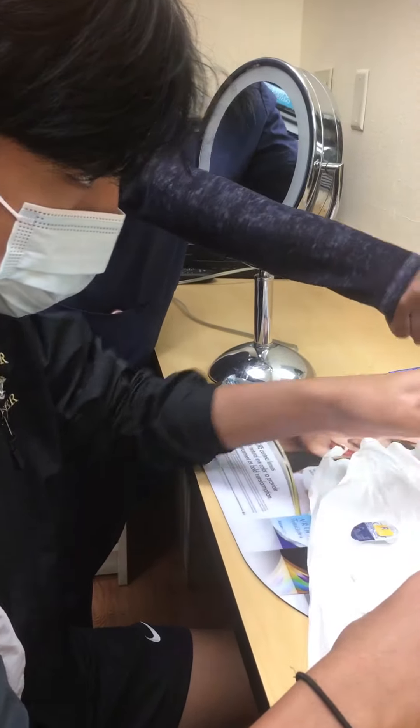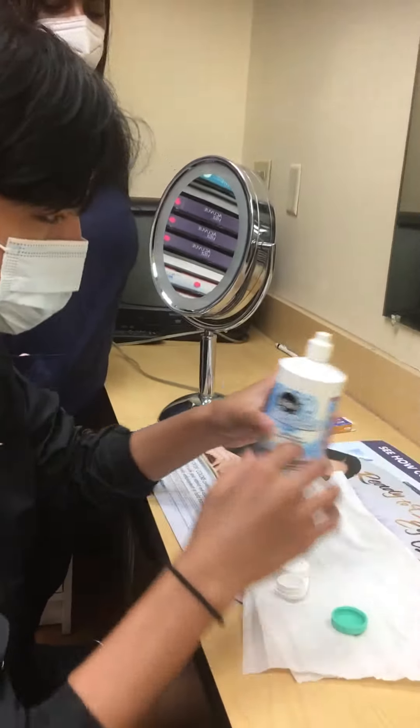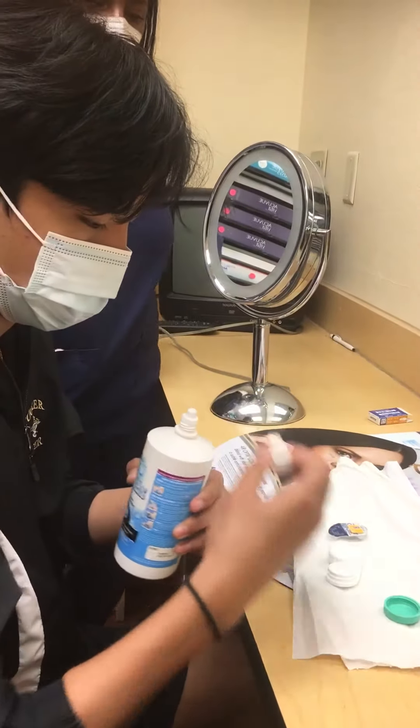Then you're going to open up this and pour some solution in there, okay? In here? Uh-huh, you're going to pour some. So we're going to put the contact — when you take it out, you're going to put it in there.